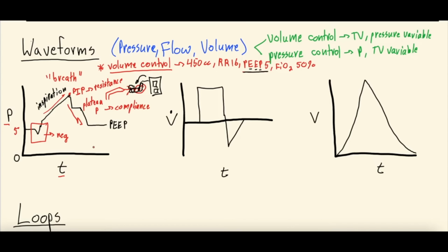And that is under volume control during a single breath. If it is under pressure control, so we said this is in volume control, we're just going to draw right here quick. If it were pressure control, just the shape of the curve looks a little different, because you're setting the pressure, so it'll look more boxy, right? So it'll look like that, although I apparently am a little slanted. That was unintentional. But it'll just go straight up like this and come down. And this would be under pressure control settings. So again, you still have your PEEP here.